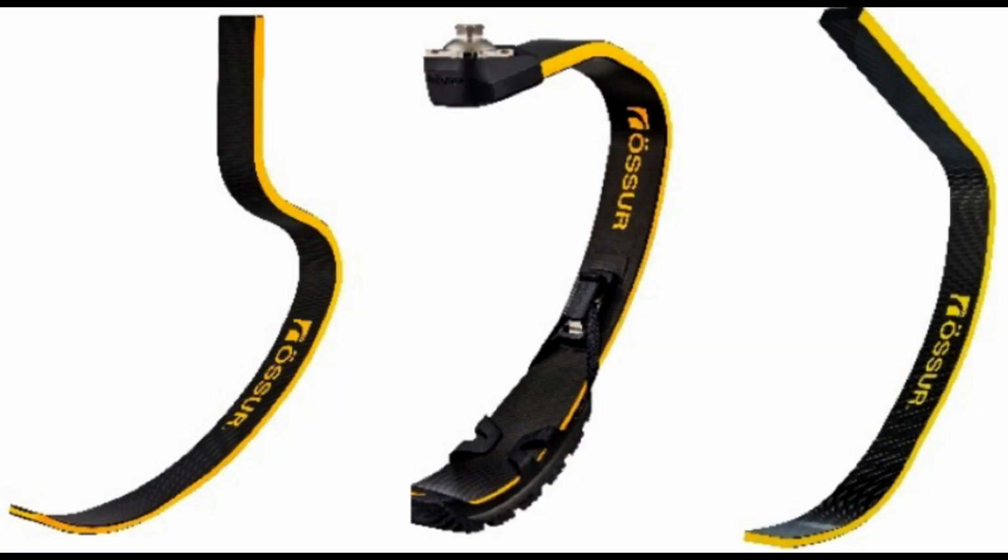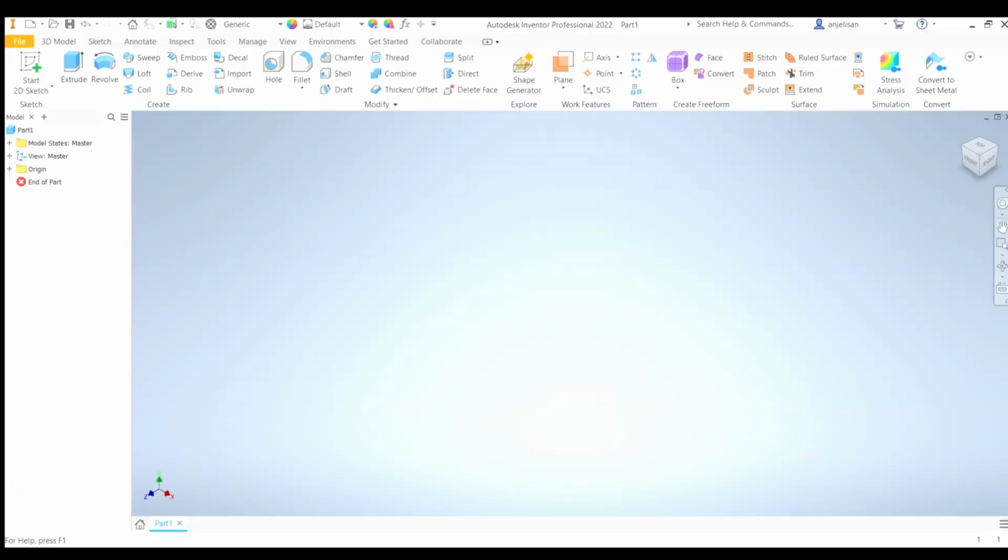And this picture here shows a variety of those cheetah blades. You'll notice that in every single one of them, even though they have slight differences, they follow this signature J shape, right? So this is very good if the person wants to push down on this and basically spring off of that foot. So that is what we were trying to make.